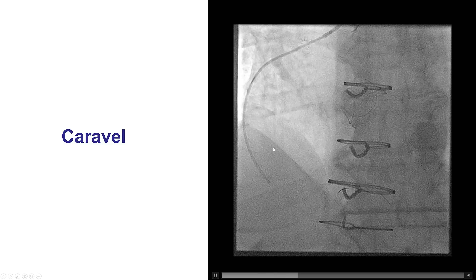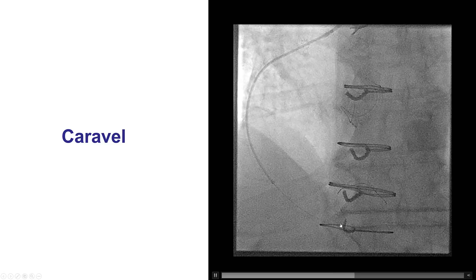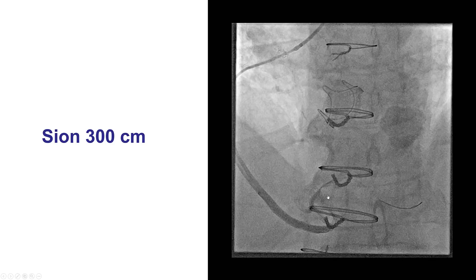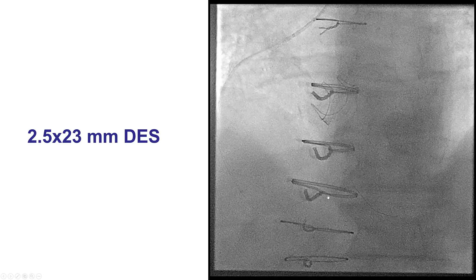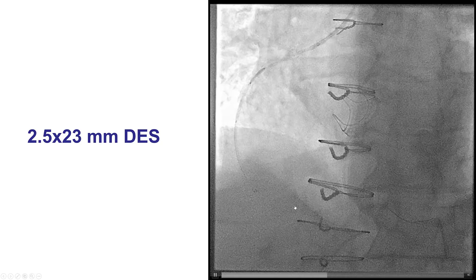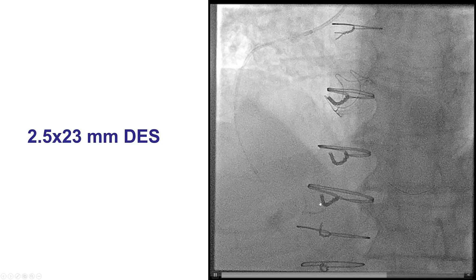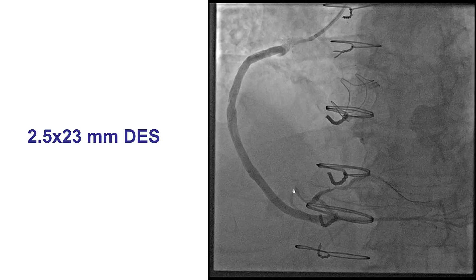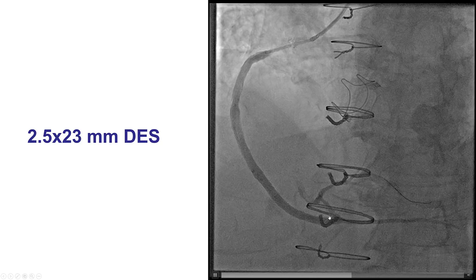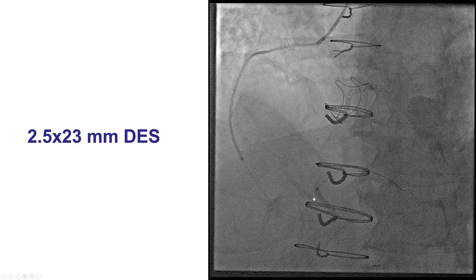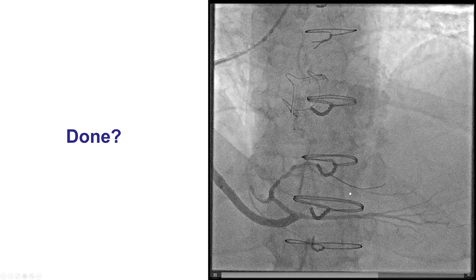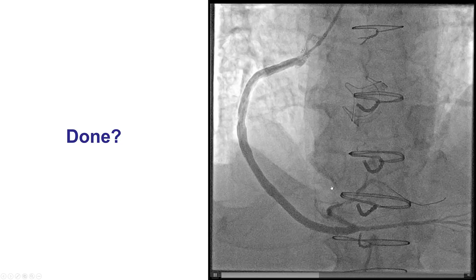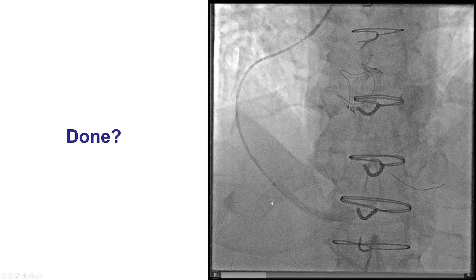The wire was confirmed to be out — likely a dissection plane. We advanced a Caravel microcatheter once more and changed to another long Sion guidewire, confirming good position. There was residual disease more proximally, so we delivered an additional 2.5 by 23 mm drug-eluting stent to cover the proximal part that was likely injured from prior balloon inflations. That stent was positioned in the proximal PDA, proximal to the touchdown of the saphenous vein graft, and successfully deployed.